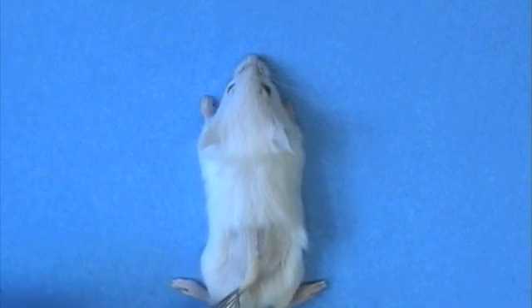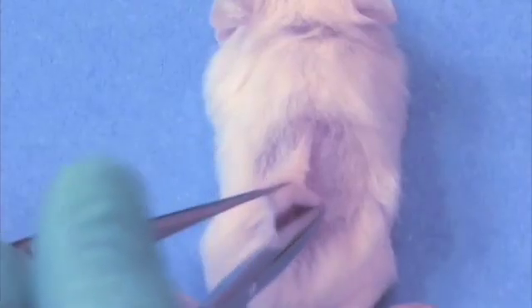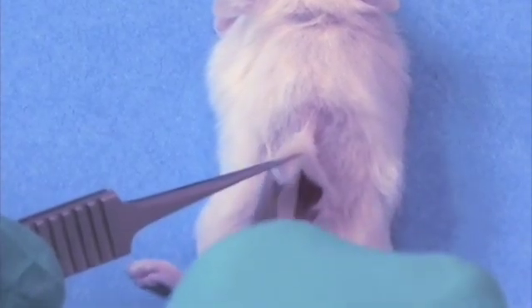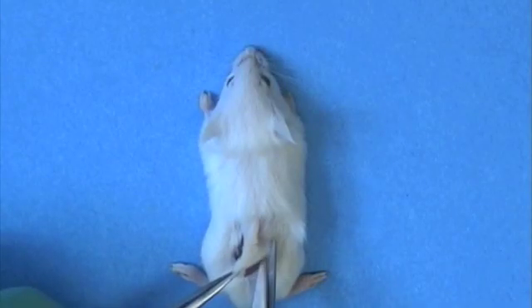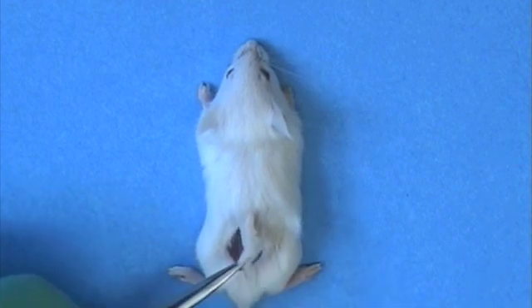When you're doing your dissection, you want to be very careful not to put your forceps in the areas of the skin that you want to use for your assay. So, what we do is we just put the forceps around the edge of where we're going to cut, and then you lift very carefully, cut the epidermis, remembering not to touch the area that you want to use for your experiment.